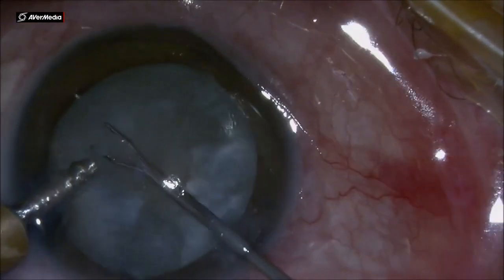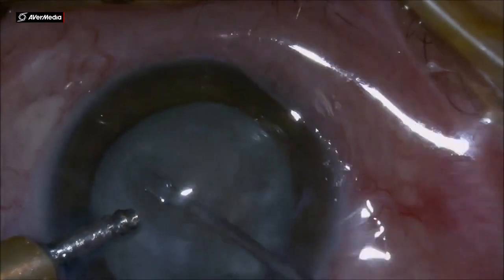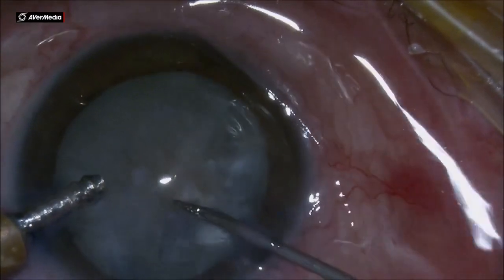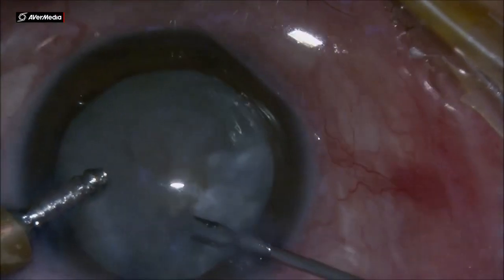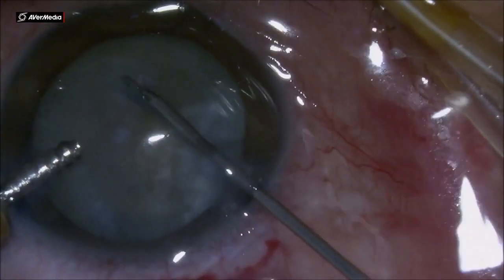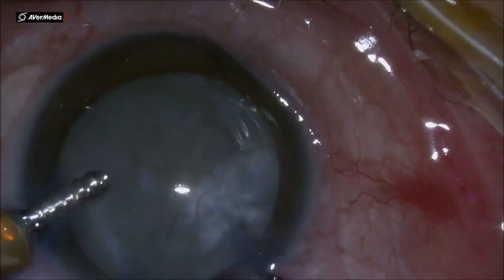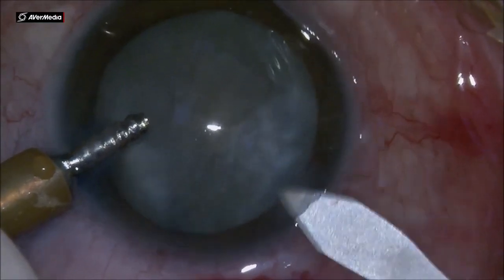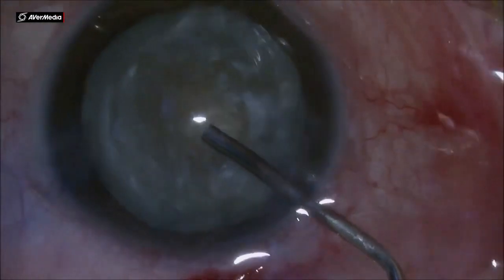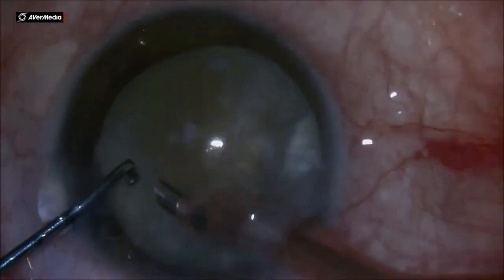It's very hard to distinguish the anterior capsule, even with that trypan blue, but I managed to fashion a large and round capsulorhexis. It's especially important in these leathery cataracts to have a large capsulorhexis to be able to maneuver that nucleus inside the bag really well.